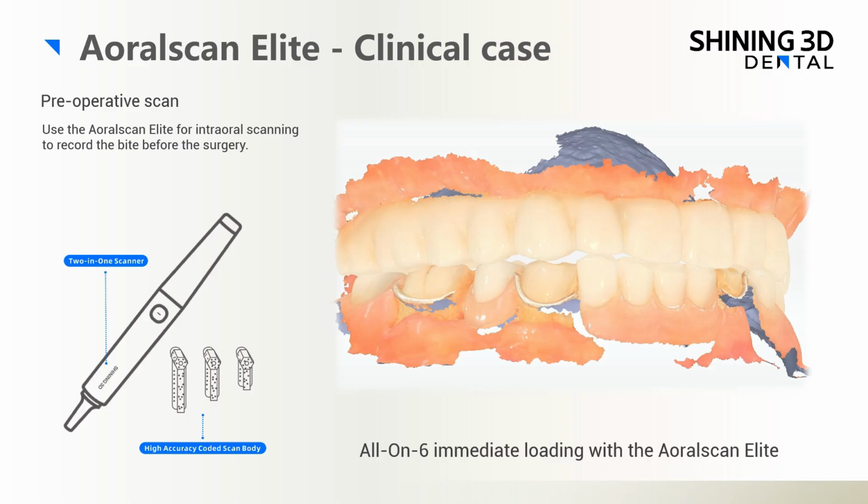Okay, now let's take a look at this real all-on-6 immediate loading clinical case using Aoralscan Elite for a better demonstration of the new scanner. A 70-year-old patient came to Dr. Sun's clinic to replace missing teeth in his mandible.